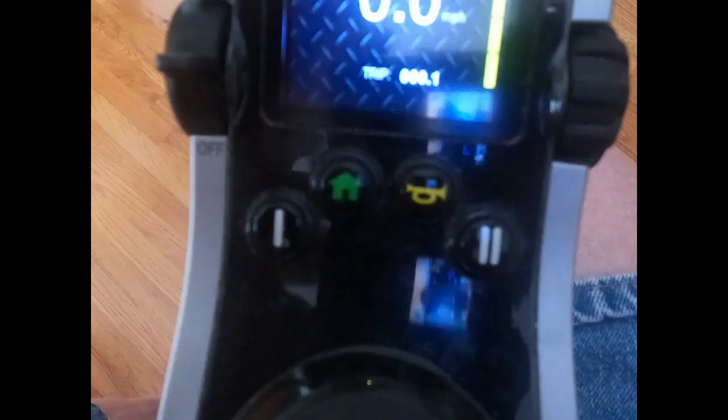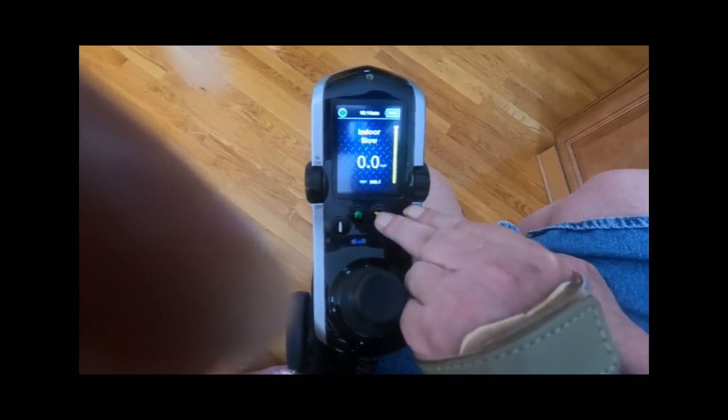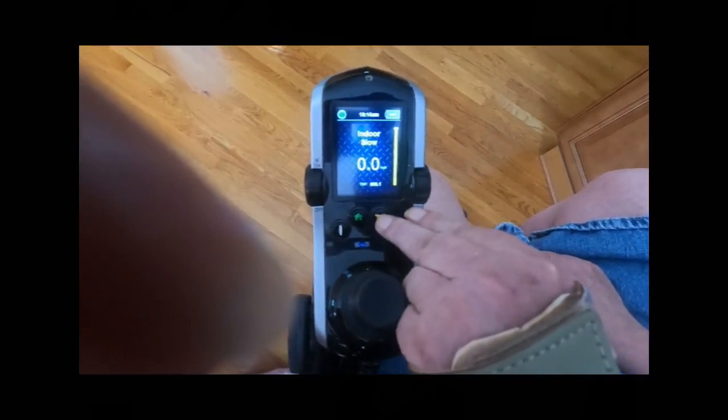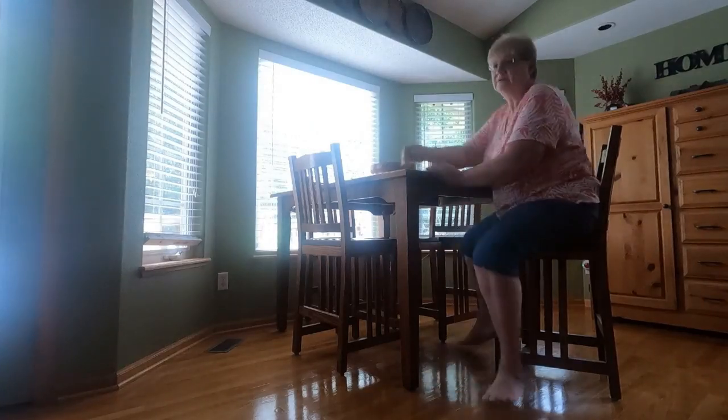So what are some of the other features found in this joystick controller? As the horn symbol indicates, this chair has a warning horn with an adjustable sound level that's really not loud enough to be heard in any heavy traffic situations, but is definitely loud enough to alert others in your house if you have a problem. For example, if you start choking and need assistance, I'll lay on the horn to signal that I need help.